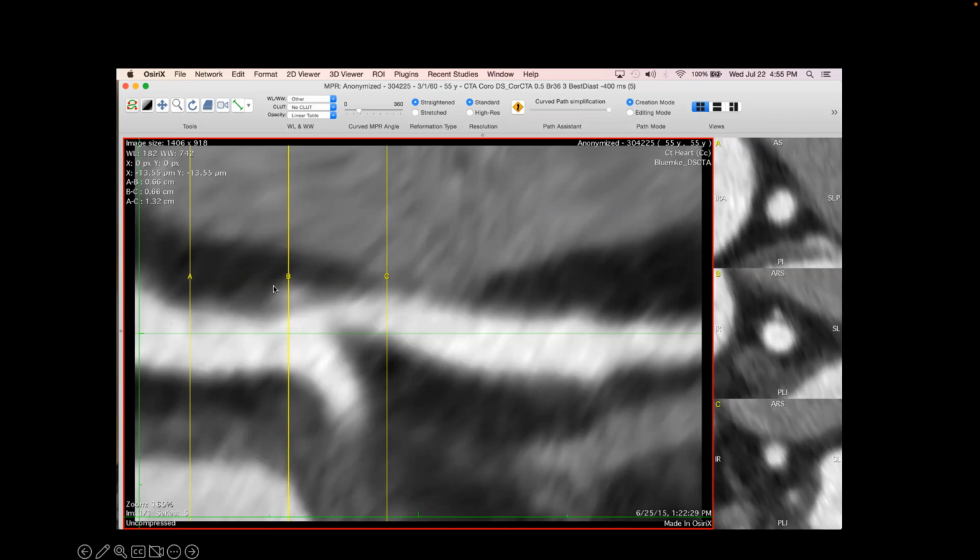And in this case, the lesion also has a little chunk of calcium in it. And so this is why we need high resolution pictures, right? And why we're pushing image quality into high resolution pictures. And obviously, we need motion correction when we're looking at pixels that are on the order of 1/4 millimeter, because holding the body still to that threshold is really hard.